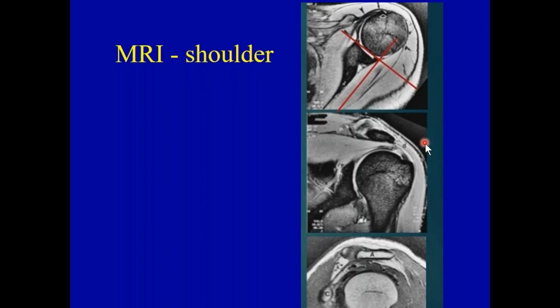The other thing that's happening is now, instead of paying an awful lot of money for an MRI examination, there's a diagnostic ultrasound tool that's been used in musculoskeletal radiology that has very good information regarding supraspinatus tears and pathology of the shoulder. So that examination is a lot less expensive than an MRI, so the landscape is shifting.